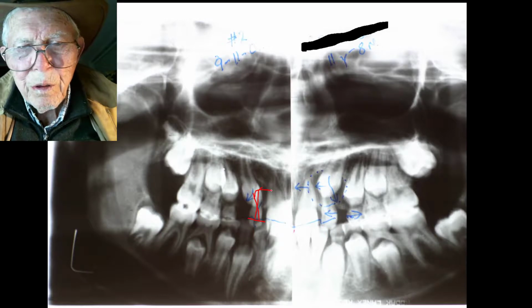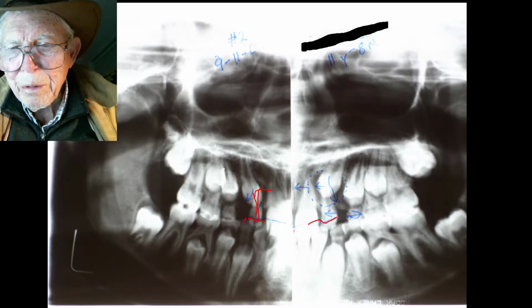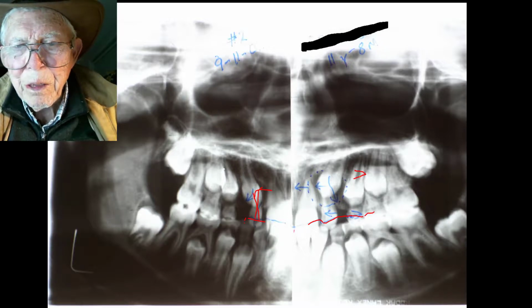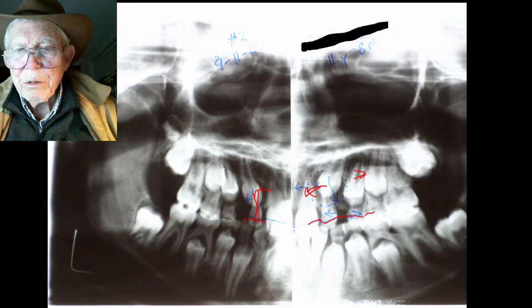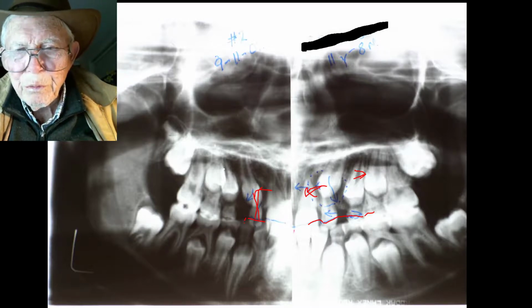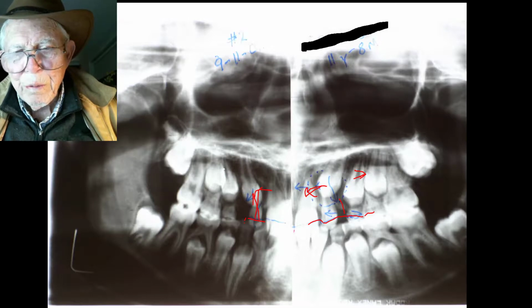It'll move over, and we'll get the cuspid coming down in that gap. And here you see that arch wire coming over, and do it like this over here. So we're pushing this one back here, this lateral especially, over in this direction. But still, there's not enough room to get this cuspid in. So we have to go back and come up with something else.